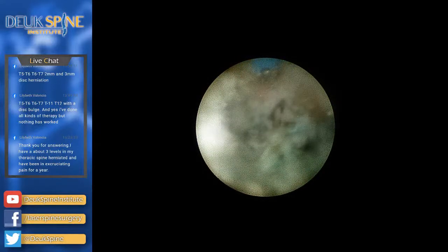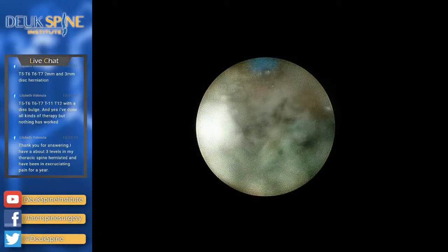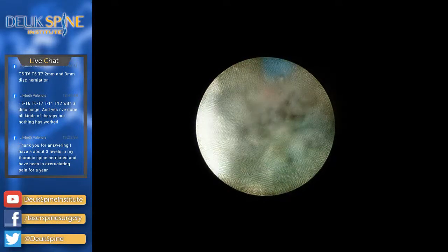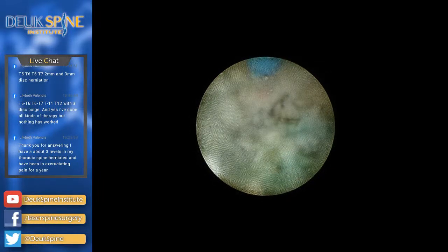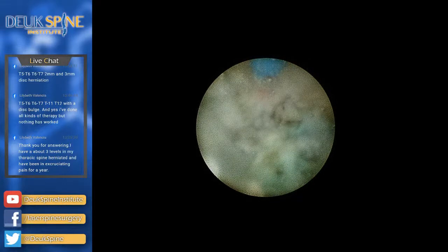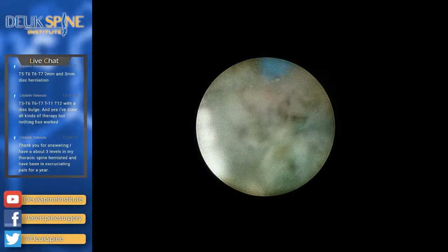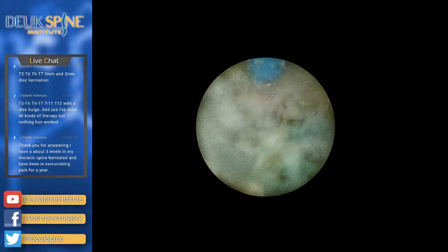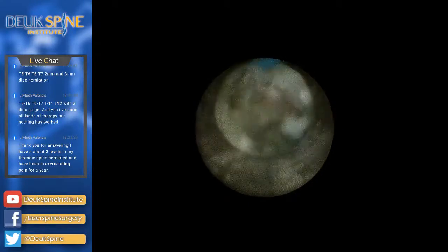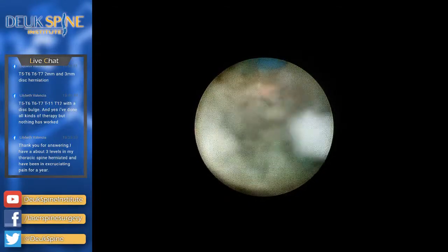The alternative surgeries, if anybody even offers it to you, are much more invasive and involve fusing with screws and rods and horrible, painful incisions called thoracotomies with resection of ribs, and then you get pain afterwards, thoracic neuralgia and all kinds of problems with your internal organs because you have to collapse the lung and move it over and all this stuff. So the best surgery in the world for thoracic disc herniation is what you're watching right now. There's nothing even close.